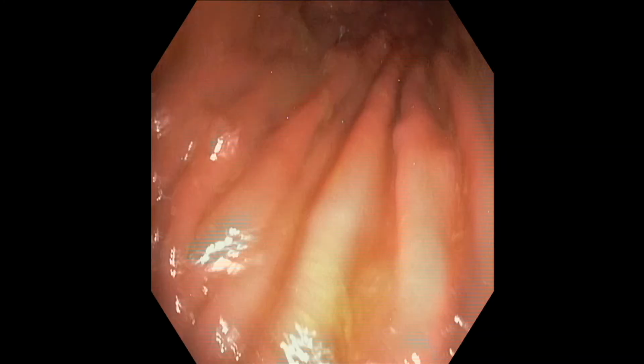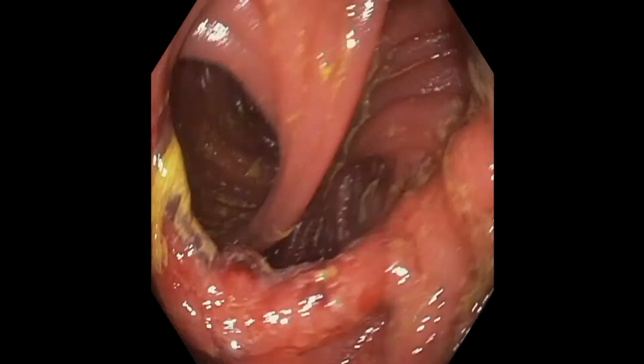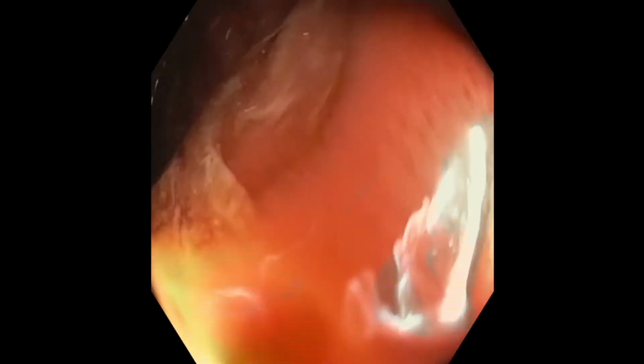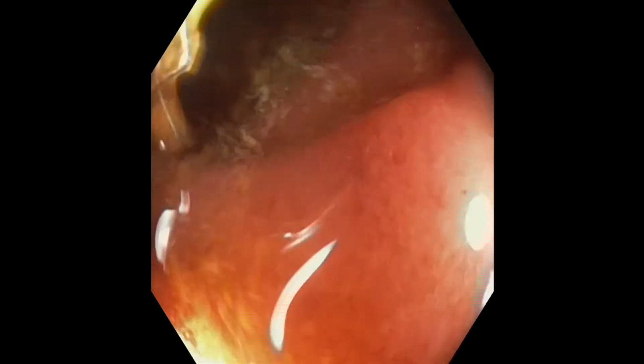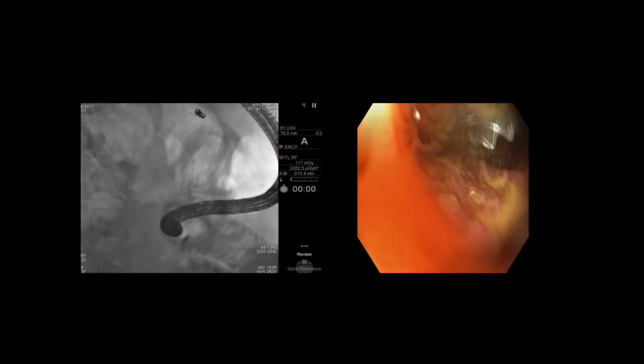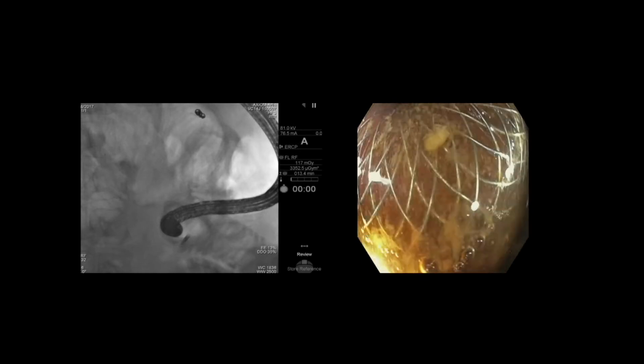At this time, the upper endoscope is reintroduced to confirm proper positioning of the Lumen Apposing stent. Initially, the efferent outlet is entered across the stenosis as seen here, and the endoscope traversed until the Lumen Apposing stent is identified. Again, large amounts of afferent limb contents are seen draining through the stent. The position is confirmed endoscopically and fluoroscopically.